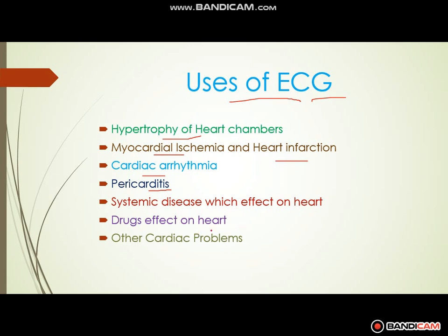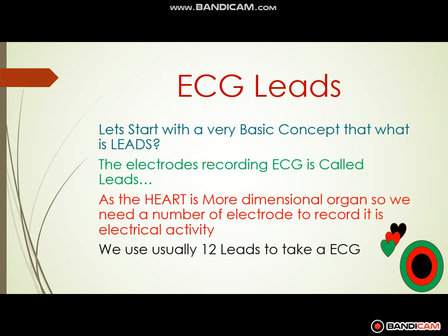When we give a drug to a person, we can easily see the changes or the effect of that drug and the heart rhythm in the ECG. We can diagnose it, and we can use ECG for other cardiac problems. And then the other thing is ECG leads.